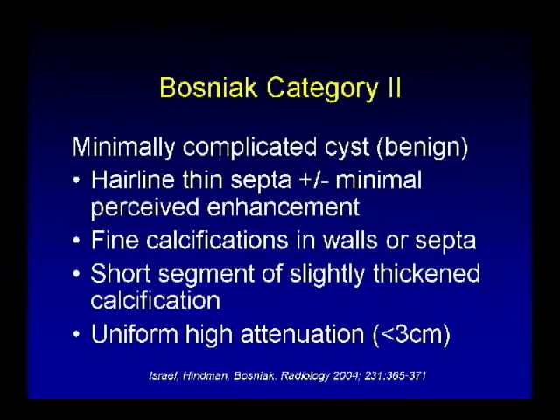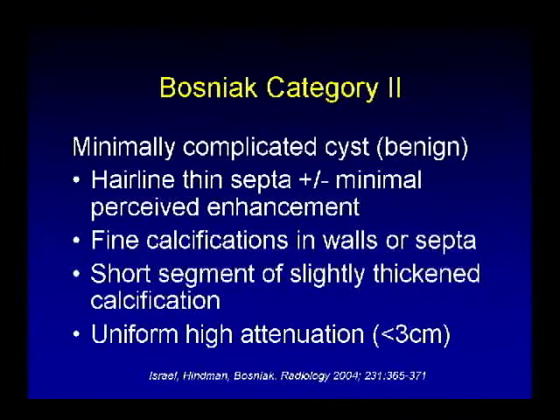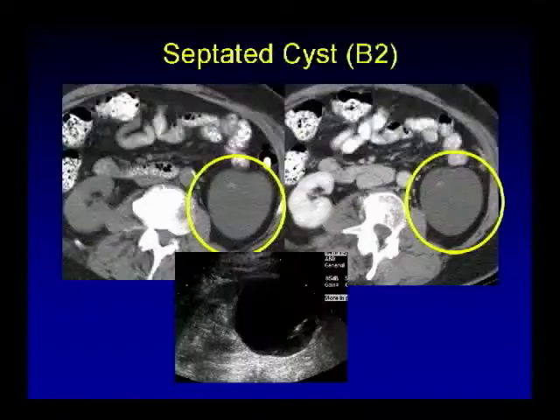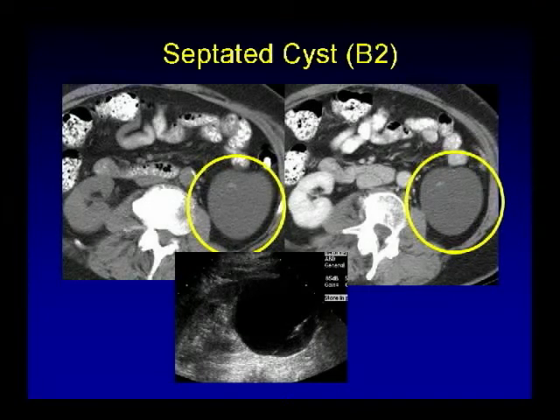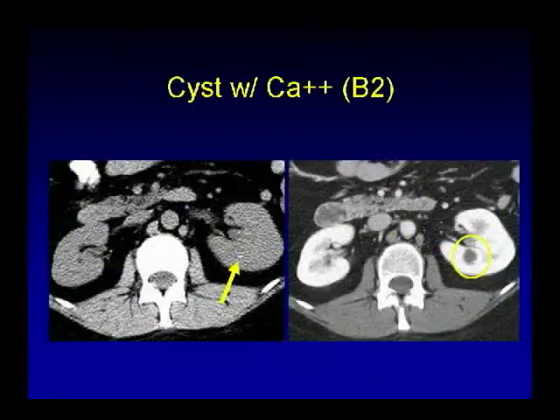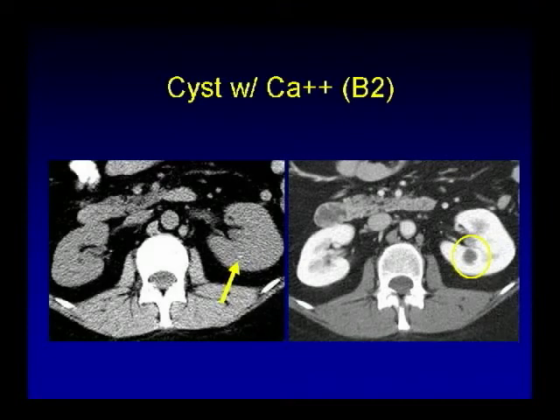Type 2 cysts are minimally complicated but still benign. They may have hairline thin septa, possibly minimally perceived enhancement, fine calcification in walls or septa, short segment of slightly thickened calcification, and uniform high attenuation such as hyperdense, but should be less than 3 cm to be categorized as Bosniak 2. Here's an example of a large cystic lesion from the left kidney with suggestion of calcification within a barely perceivable septa — Bosniak type 2, benign.